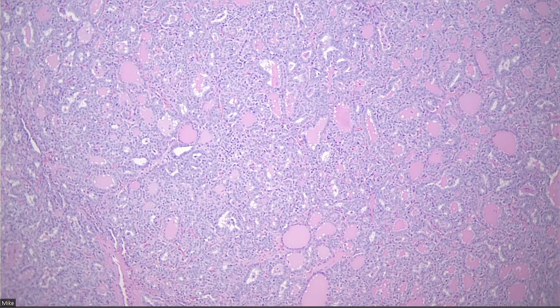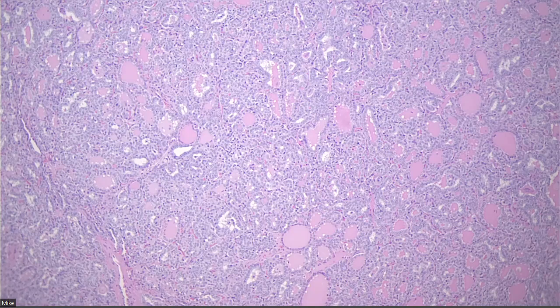This didn't have any metastases at the time of presentation. It's small, it's circumscribed, BRAF V600E negative, and no nodes. It may still qualify the patient for observation rather than completion thyroidectomy, but maybe the index of suspicion that this is going to recur or metastasize in the future is higher than if it were completely RAS-like, a non-BRAF V600E-like thing. I'd have to check what happened to her.